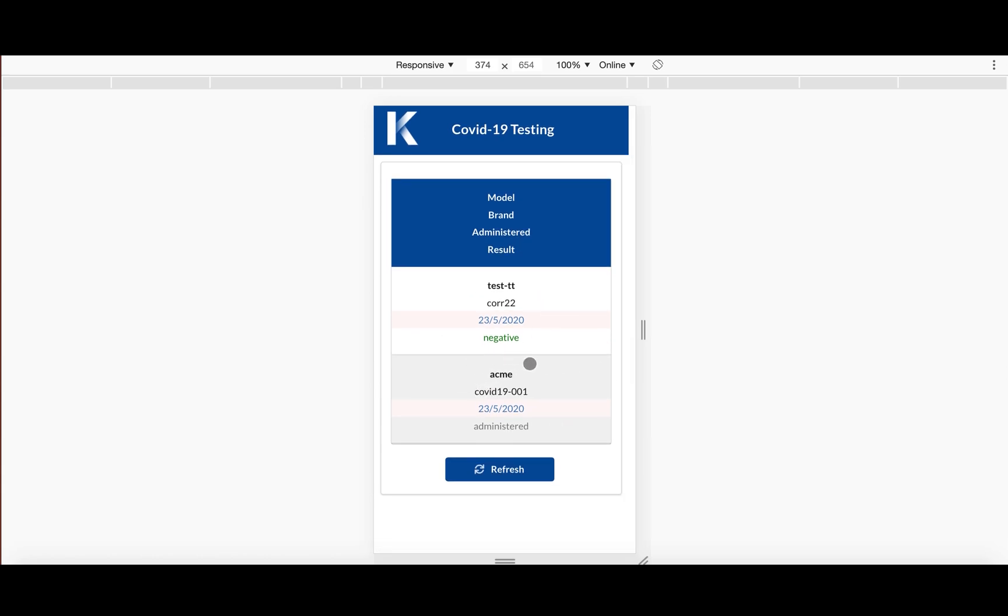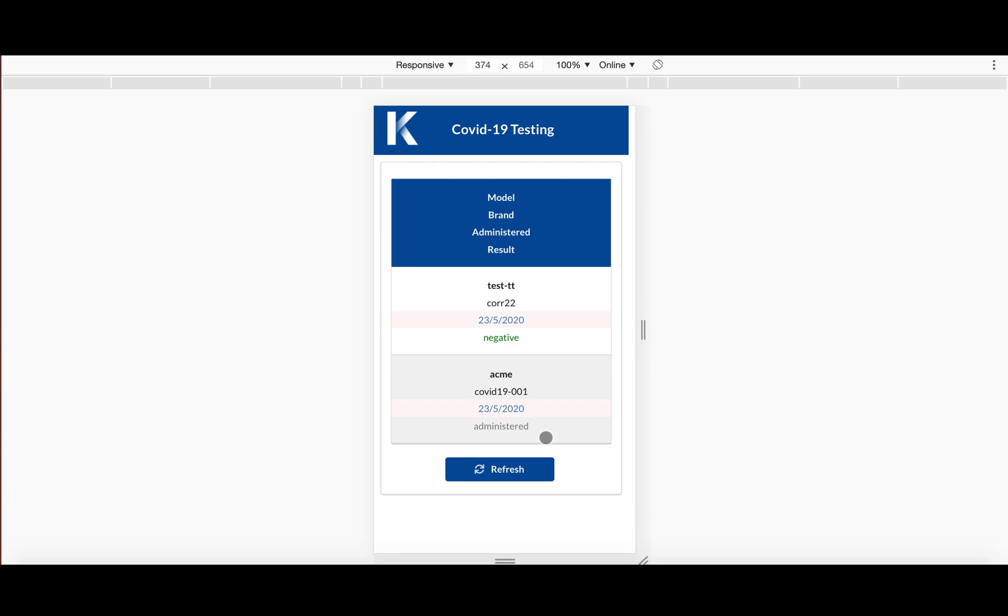And here you can see this test was a test that I'd done before. And here's a test that we just walked through earlier. As you saw, it was a brand called Acme. The name of the test was COVID-19-001. It was administered today.